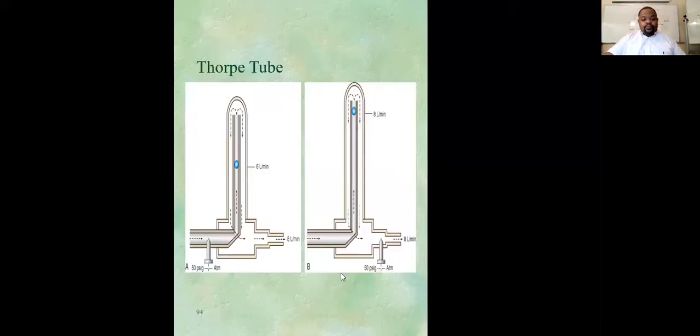All right, look at this. We said that this is compensated on this side. The needle valve is distal to the float, which means after the float. Or if they say the float is proximal to the needle valve, that's true. The float comes before the needle valve. This is compensated. Uncompensated, the needle valve is proximal to the float.